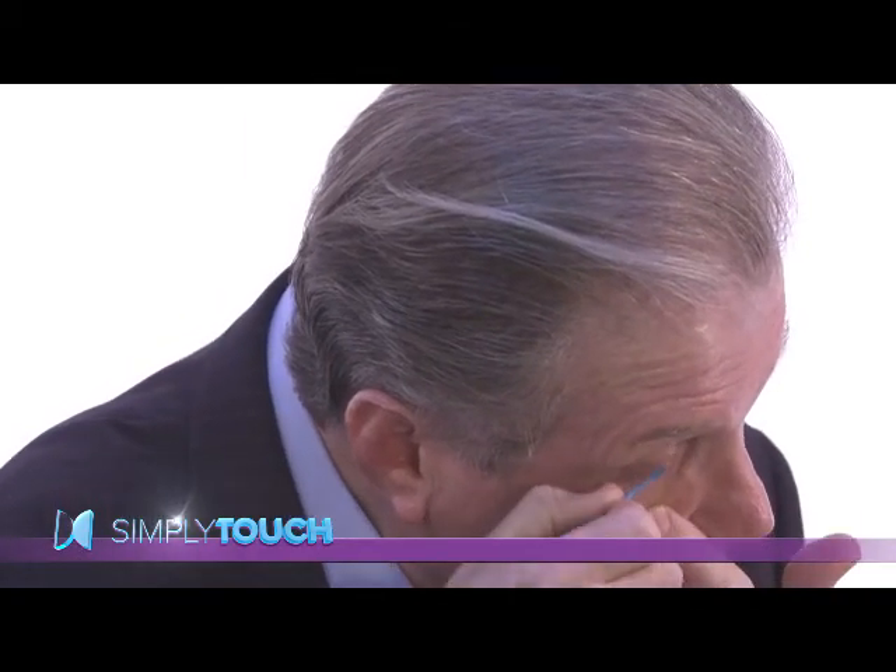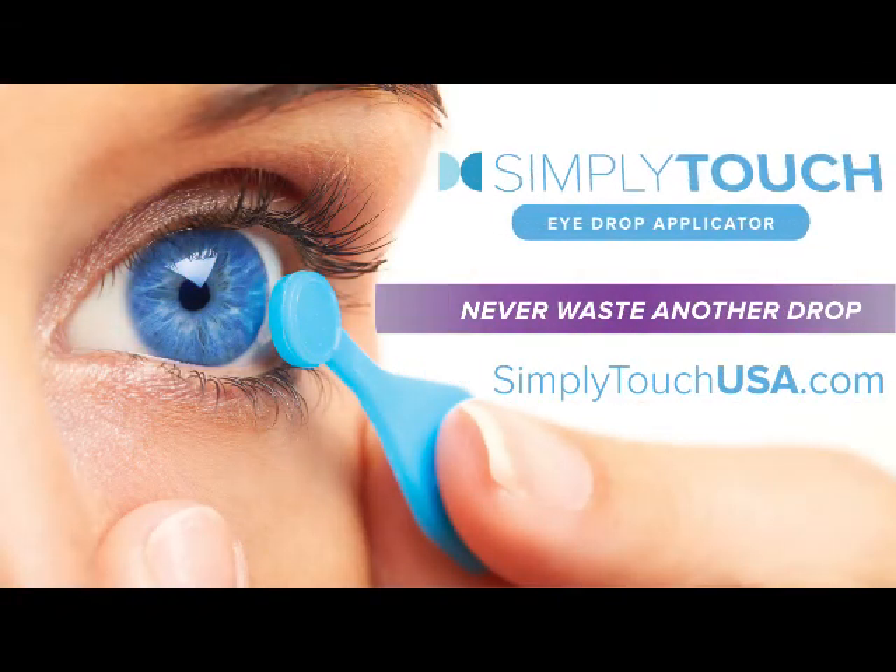Using a mirror reduces the blink reflex. Because the applicator is not coming into your line of sight, those that could not self-administer drops now can. Those that ran out of drops due to missing now won't.